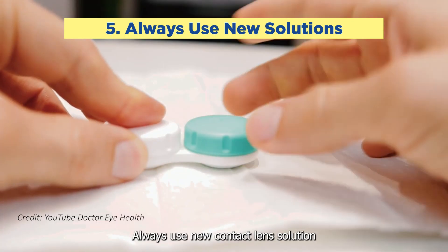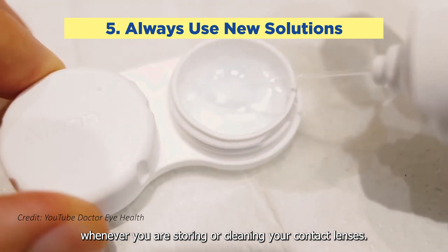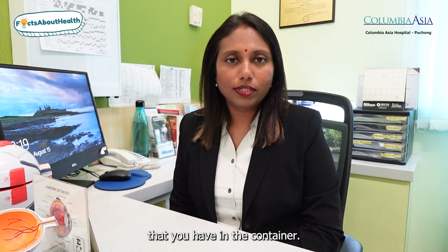Number five: always use new contact lens solution whenever you're storing or cleaning your contact lenses. Never reuse a solution or top up on existing solution that you have in your container.